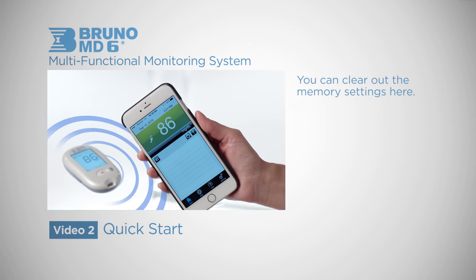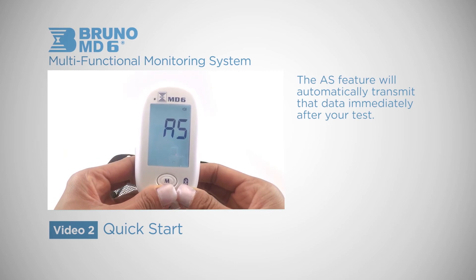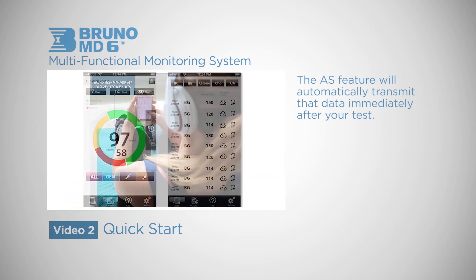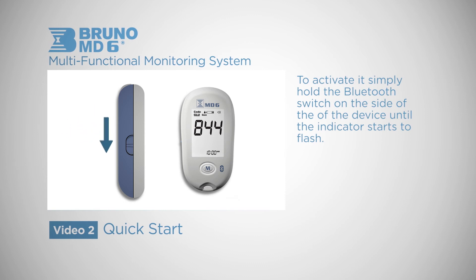One of the unique features of this device is the synchronization with your Bluetooth-enabled mobile device. The AS feature will automatically transmit data immediately after your test. To activate it, simply hold the Bluetooth switch on the side of the device until the indicator starts to flash.